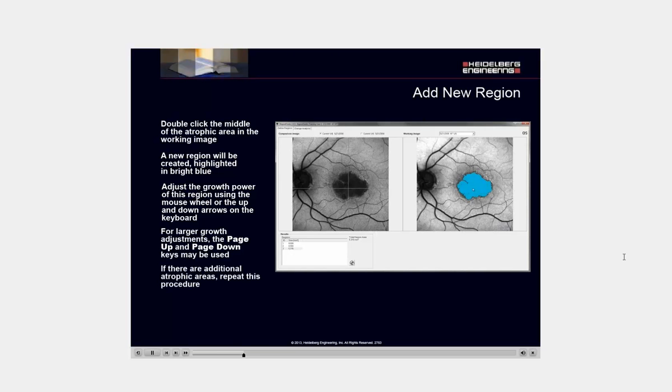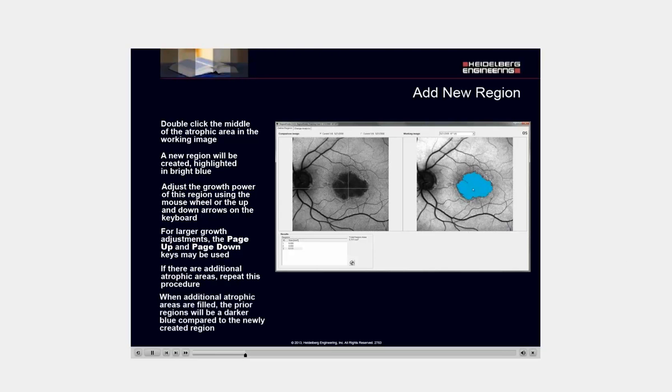For additional regions, repeat this procedure. If you add additional atrophic areas, the prior regions will be a darker blue compared to the newly created region.